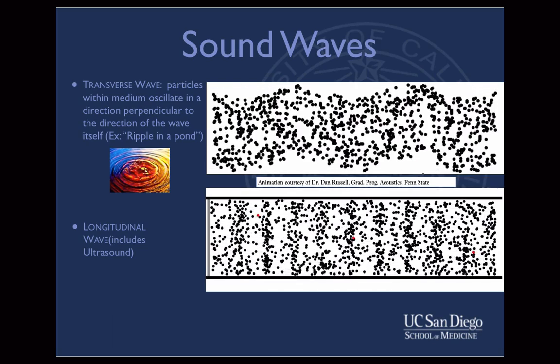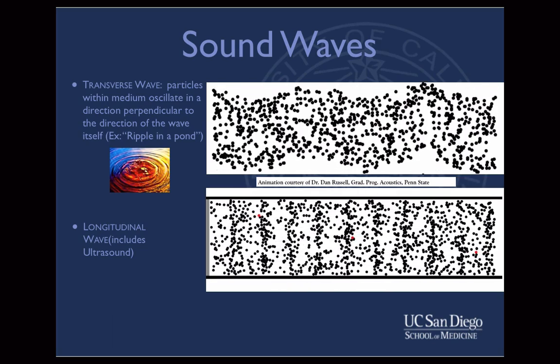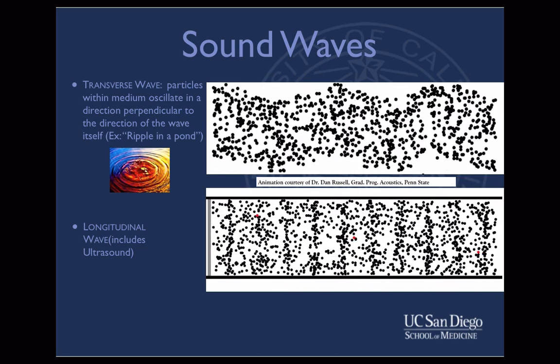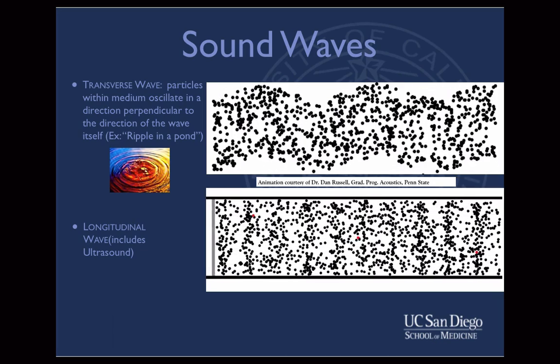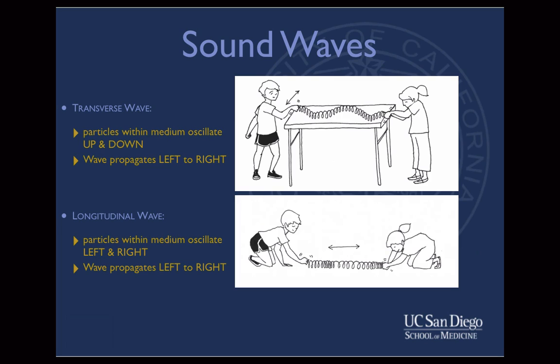This slide visually demonstrates the difference between longitudinal waves and transverse waves. Note the direction in which the particles in the medium oscillate. This slide also demonstrates the difference between longitudinal waves and transverse waves.